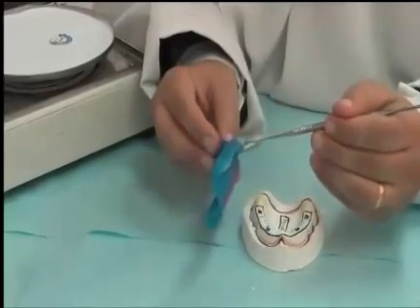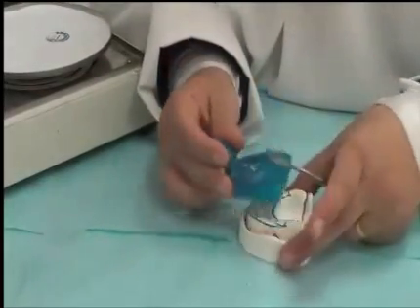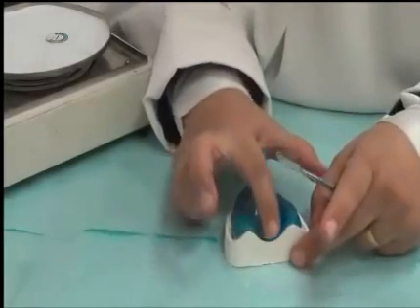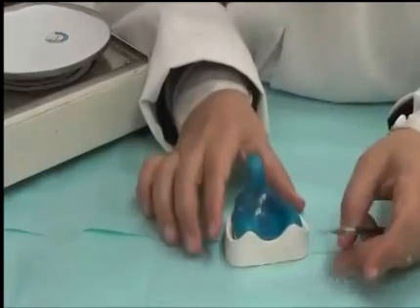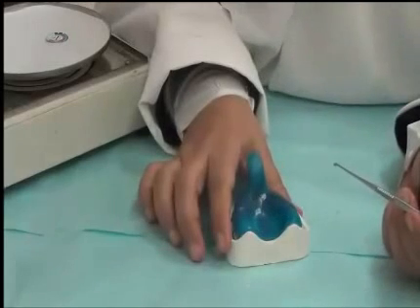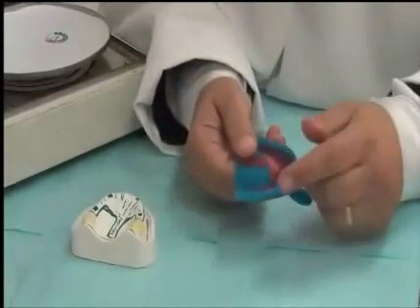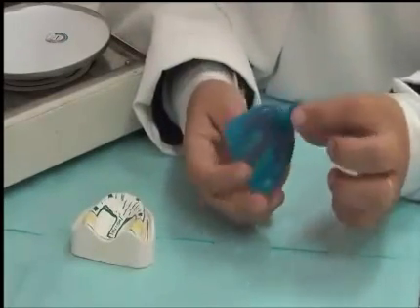The borders are fully cured, the handle is fully cured, and these borders follow the border shape we had in the beginning. And notice that the adaptation of the tray in this case is fully adapted. Not a lot of shrinkage happened because we covered the filleted area and reduced the shrinkage during the setting. Once we remove this, this is ready to be trimmed, smoothened, and then polished all together.